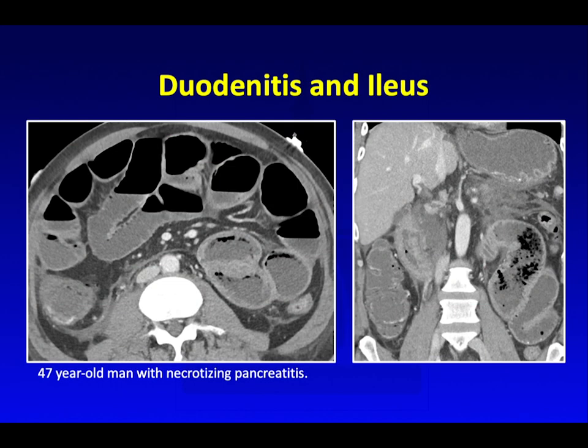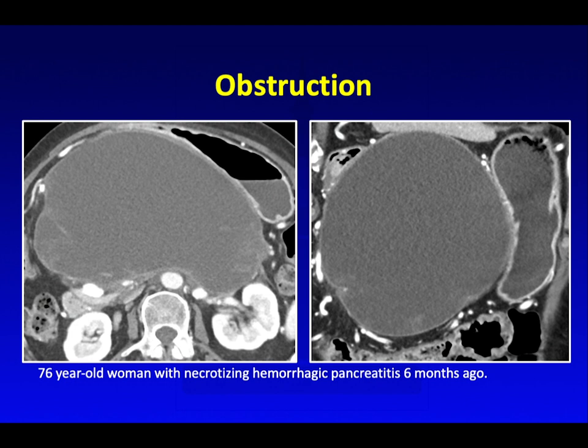Here are some examples of duodenitis and ileus. This is a patient with necrotizing pancreatitis — on the coronal image, there's very poorly enhancing pancreas. In the adjacent duodenal C-loop, you see marked bowel wall thickening, and then more globally within the small bowel, you see diffuse air-fluid distension throughout, consistent with ileus. These fluid collections can also cause mechanical obstruction due to mass effect, such as this patient with a very large fluid collection basically compressing the gastric outlet, who came in with symptoms of gastric outlet obstruction.